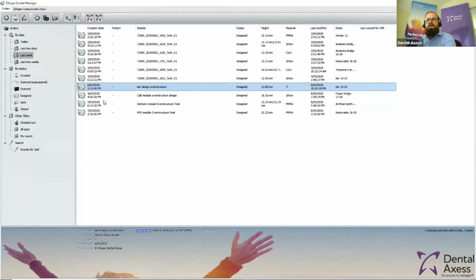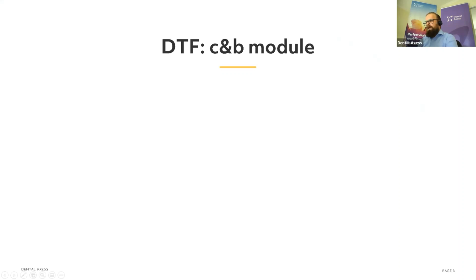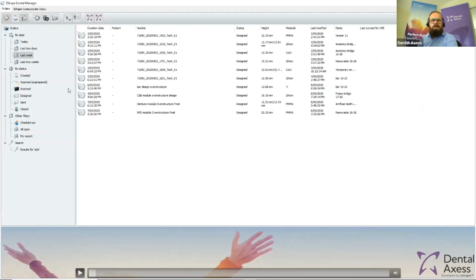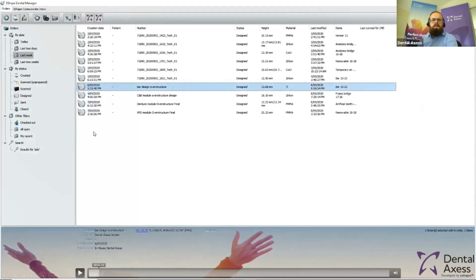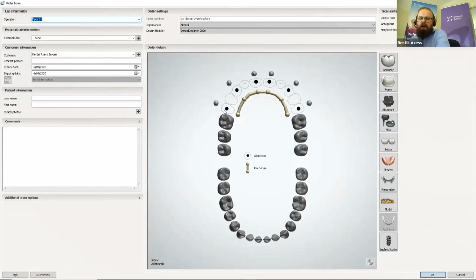I'm going to do a redesign in this case, but it's still the same steps. Sorry, that was the wrong button. What I would love to show also is, let me quickly go into it for a split second. On the top right, we have a function, a pre-scan or pre-op. With that one, what we did previously is we created a file with temporaries directly on the model, and that already gives us the teeth location.